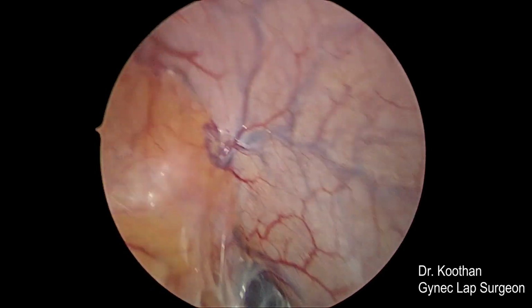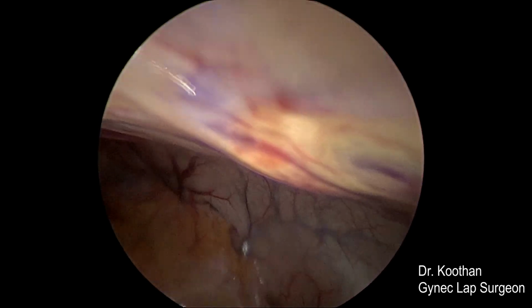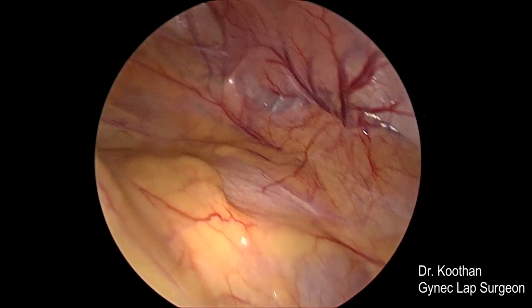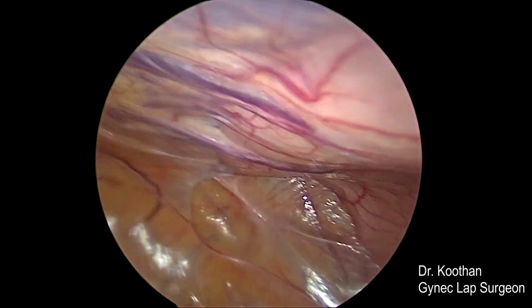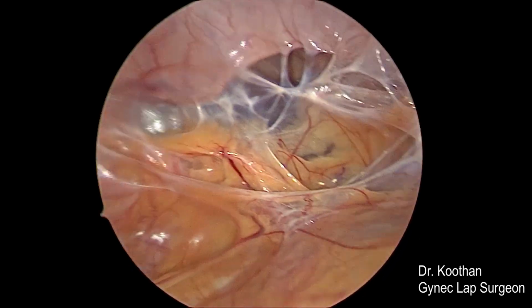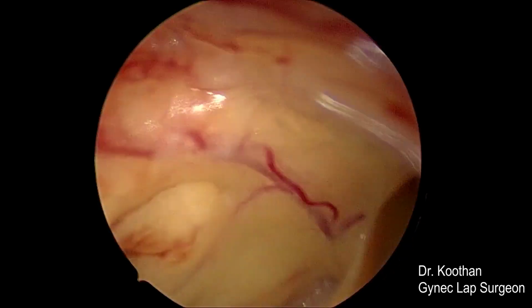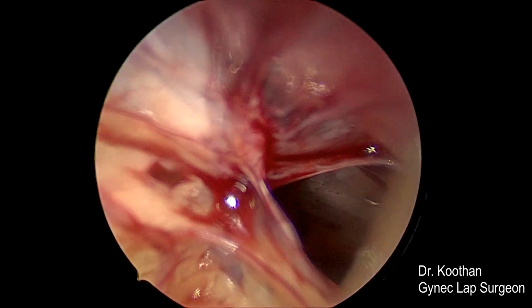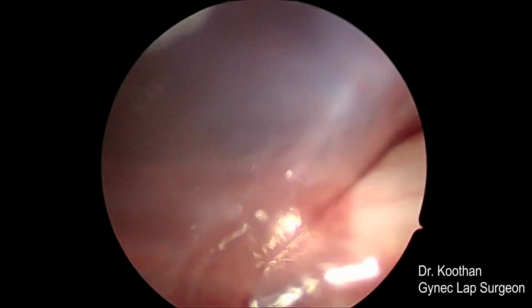Now we are searching for one other space so that we can put a secondary trocar to visualize the cavity, so that we can change the scope to that trocar and we can see the point of entry of the primary trocar, so that if any injury has happened, we can identify it. What you are seeing is the stomach, which is actually adherent to the anterior abdominal wall. We are searching for a space.